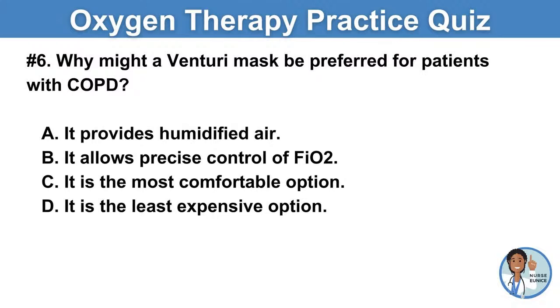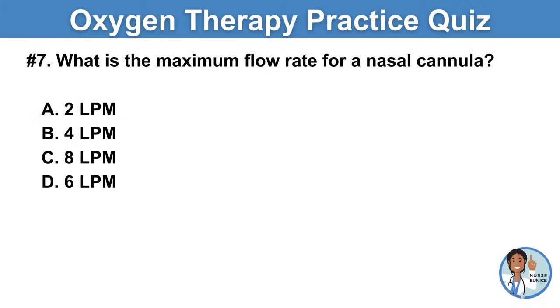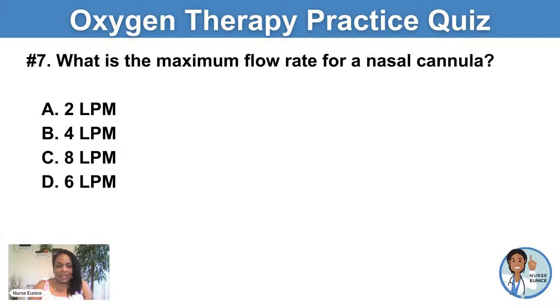And if you recall, I told you to take notes when we were talking about COPD. Yes, Flossie, Ruth, and Cassandra, you are correct. Alex and Lynn, yes. So it provides precise control of FiO2, which is crucial in patients with COPD because they can retain carbon dioxide.